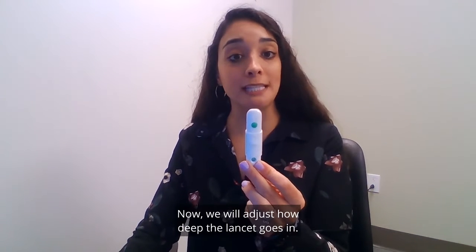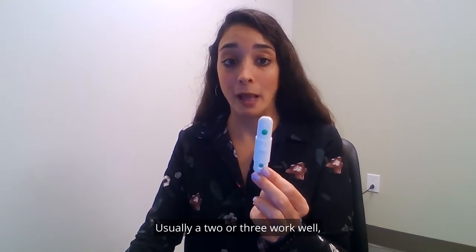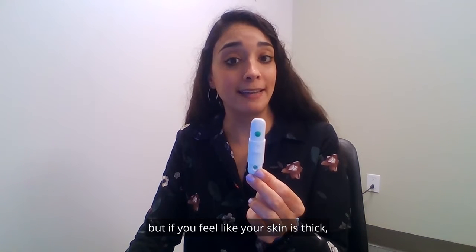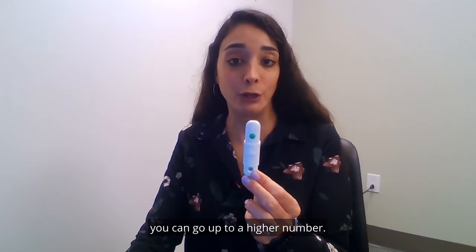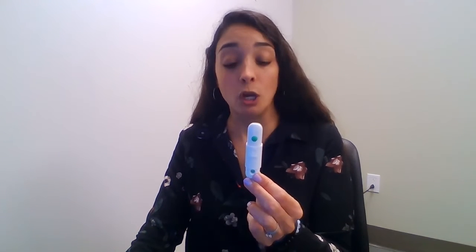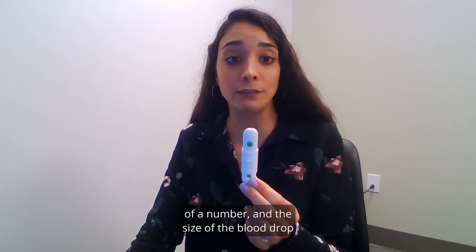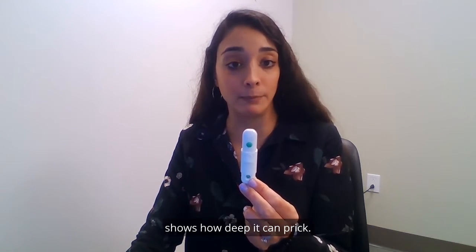To make sure it is put correctly, twist the cap in the opposite direction. Now we will adjust how deep the lancet goes in — look at the number on the lancing tool. Usually a two or three works well, but if you feel like your skin is thick you can go up to a higher number. The higher the number the deeper the prick. On some lancing tools there is a blood drop instead of a number, and the size of the blood drop shows how deep it can prick.